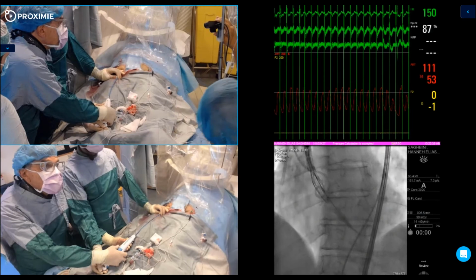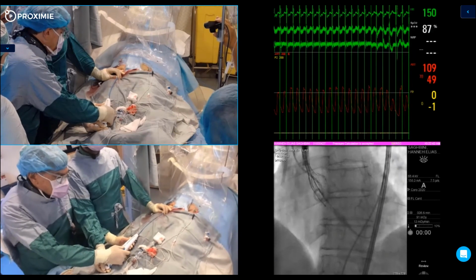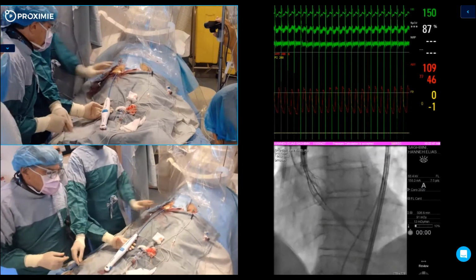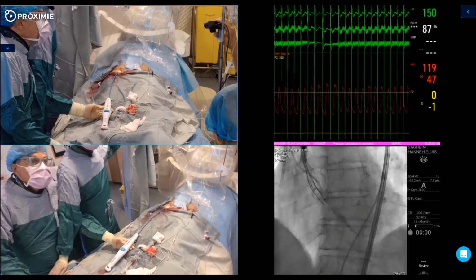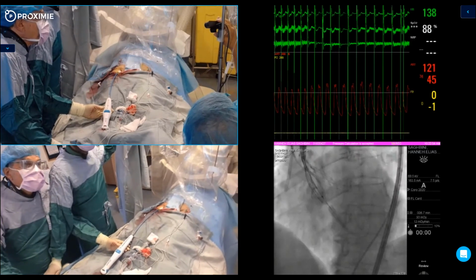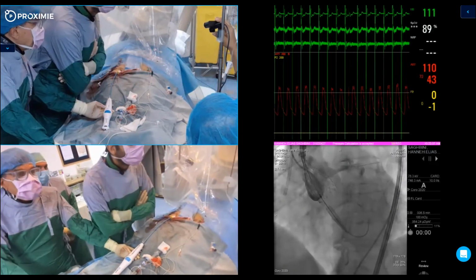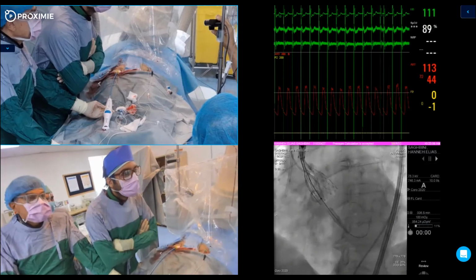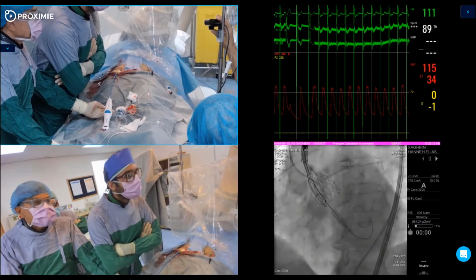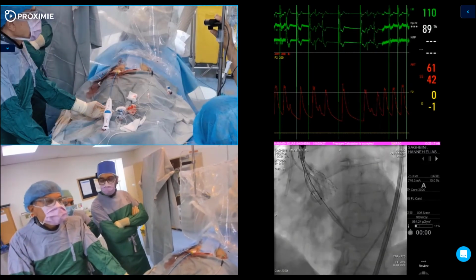Go to the hard stop. Hard stop and stop pacing. Okay, let's adjust. Okay, stop pacing. We're very high on the left side, so I bring it a bit lower.